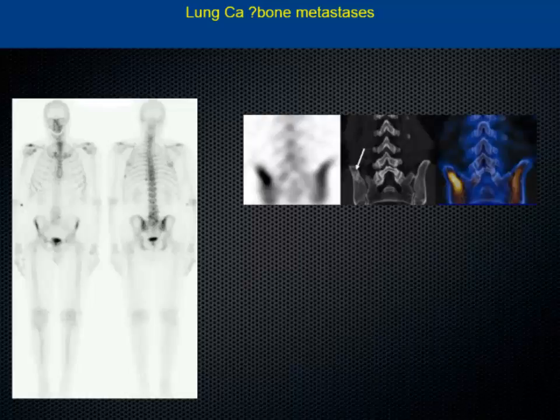There is again sclerosis in the iliac bone, and as soon as you see the sclerosis, then this fellow becomes suspicious. The rib one, you could have just said post-traumatic, or it's non-specific, because you're seeing another lesion there which is sclerosed, and that is definitely metastasis.